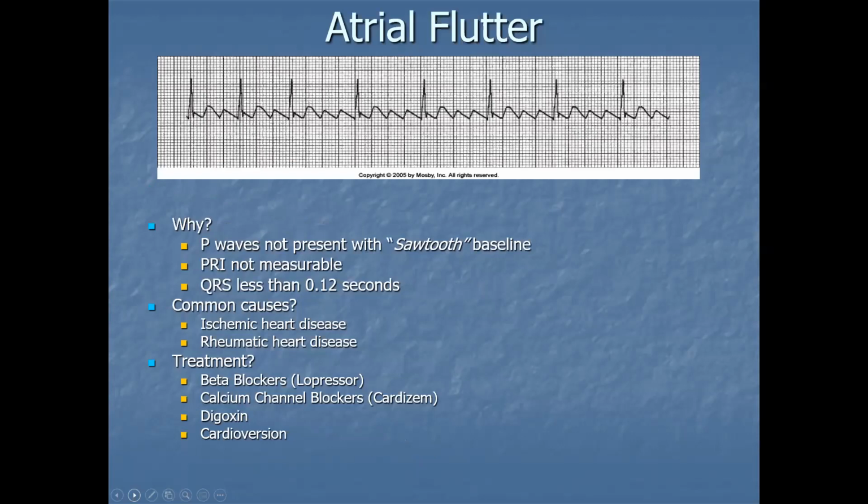Atrial flutter, where you have a sawtooth baseline. Treatment, by the way, is basically the same as it is for atrial fibrillation. So it's just recognizing the difference and understanding the treatment is similar to what you have for atrial fibrillation.